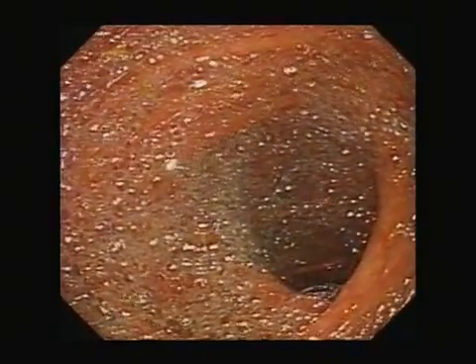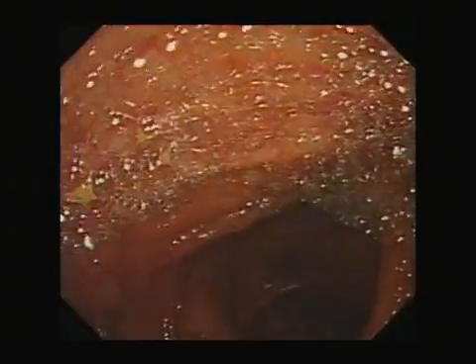Bile salts, detergent-like, can cause bubbles. Silicone solution lowers the surface tension and gives a better view.